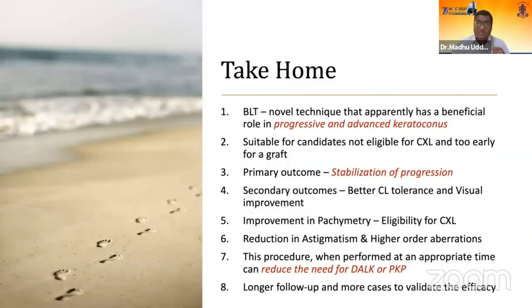So my take-home message is BLT is a novel technique and apparently has a beneficial role in progressive and advanced keratoconus. It fits into the gap of the treatment where they are not eligible for cross-linking and also too early for a graft. The primary outcome is stabilization of progression. The secondary outcomes are better contact lens tolerance and visual improvement.